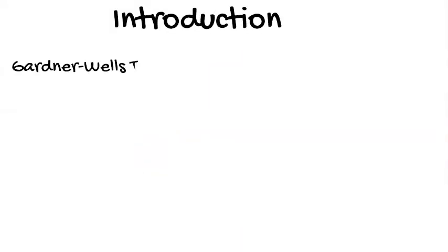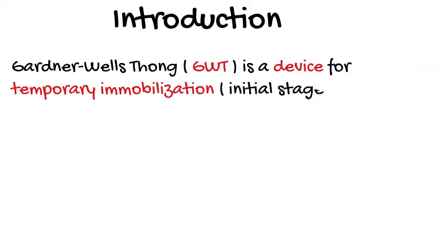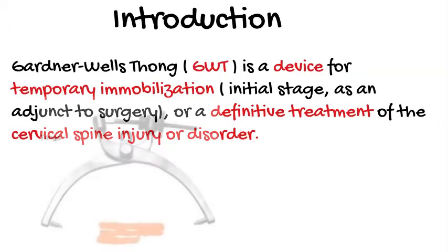As an introduction, the Gardner-Wells tongs, GWT, is a device for temporary immobilization during the initial stage as an adjunct to surgery or as a definitive treatment of a cervical spine injury or disorder.